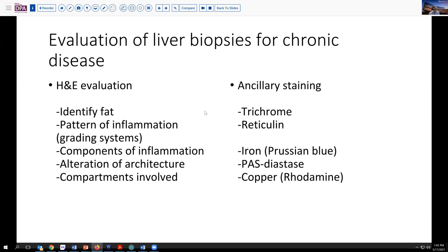Oftentimes, ancillary staining is routine, simply because we don't want to miss things that are present on the biopsy that we might not otherwise see. So even when it may seem to be of low yield, when the history is clear and the serologic results are clear, we do these stains because of that polyfactorial issue. So we do a trichrome and reticulin oftentimes routinely to detect architectural changes and indicate the staging of fibrosis. We do an iron stain to rule out hemochromatosis. We may do PAS diastase, looking for possible alpha-1 antitrypsin disease. And in some circumstances, we'll do a copper stain or rhodamine stain to exclude the possibility of Wilson's disease.